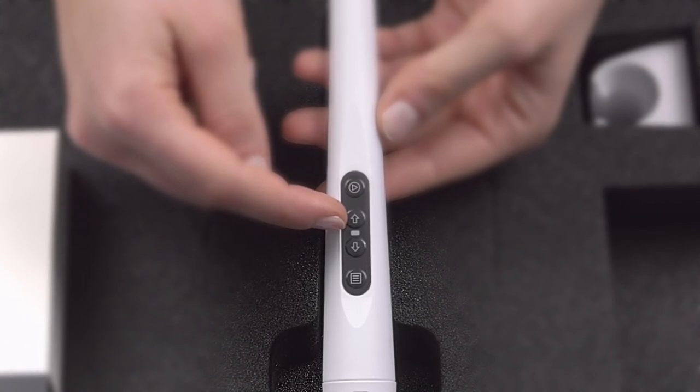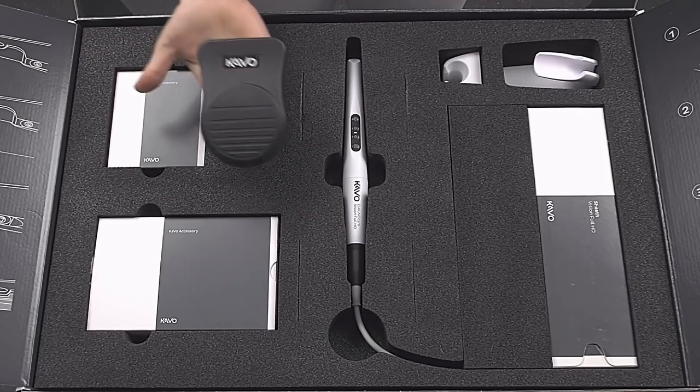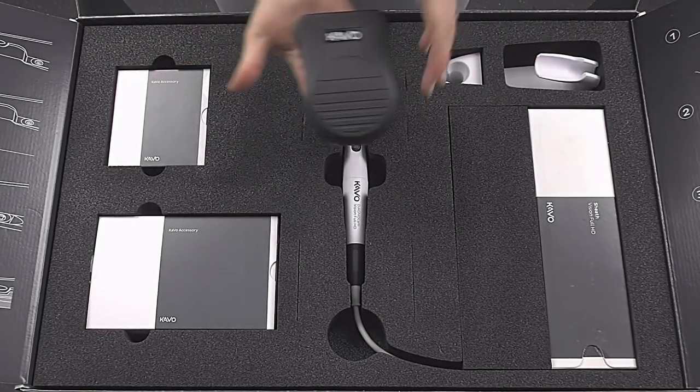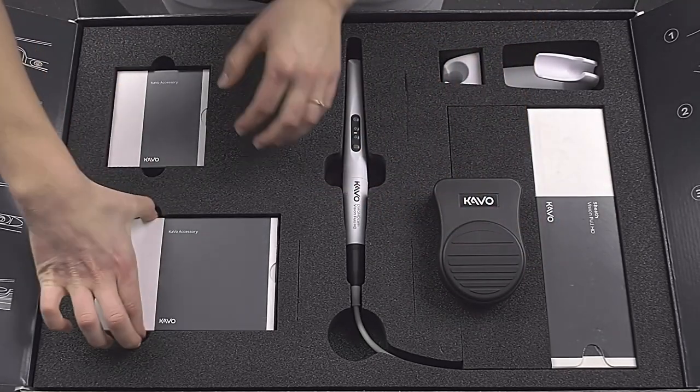The integrated LED in the middle of the touch panel shows the status of the camera — white for in operation, blue for standby, and red for error. As an alternative to the touch panel, the recording can also be triggered with the mouse on the PC, or conveniently with the optional foot control.